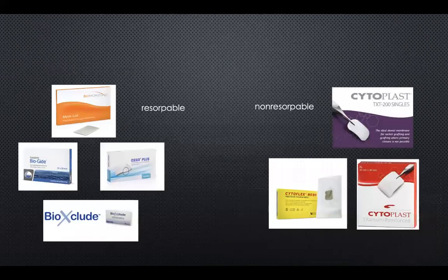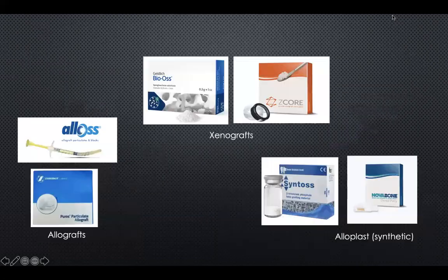So what are the available things that we have in hands? We have resorbable membranes, non-resorbable membranes. You all know about that. It's either we can have it from porcine or bovine or amnion chorion, which is allograft, or we can have it from cytoplast material that's non-resorbable. It's called a PTFE material or some type of Teflon. And we can have the same material which is reinforced with some titanium. And we have titanium mesh as well. So these are the membranes that we can use.